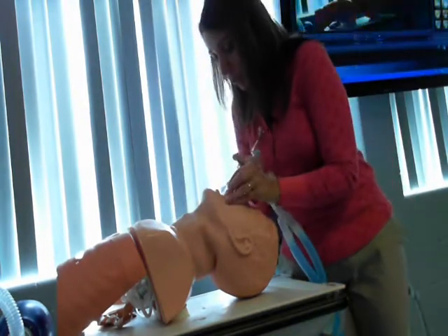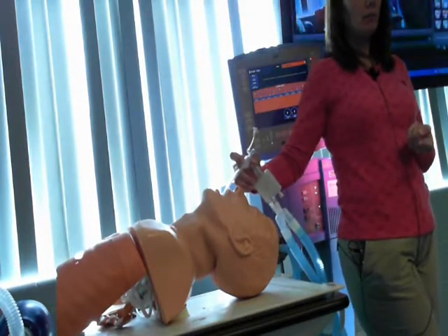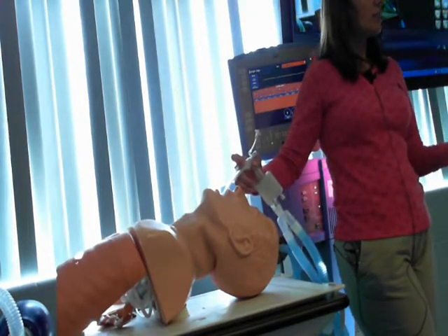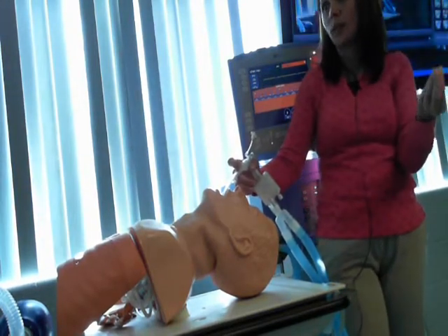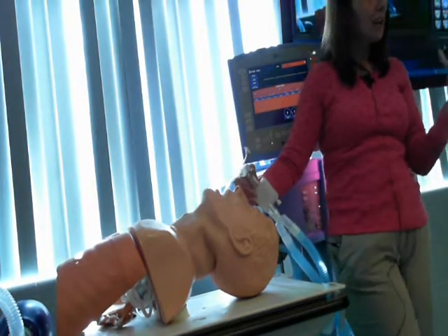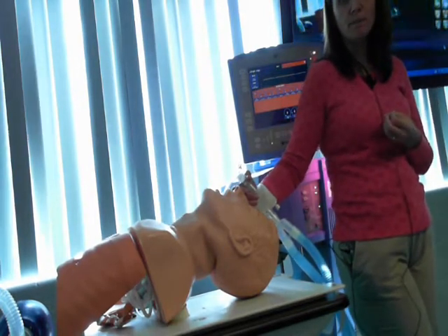And also while I'm down here, I can check my endotracheal tube placement and make sure that it's still in the right spot. So you can do 2 to 3 things all at once with that one movement and hit what are the most common causes of high peak pressure alarms.